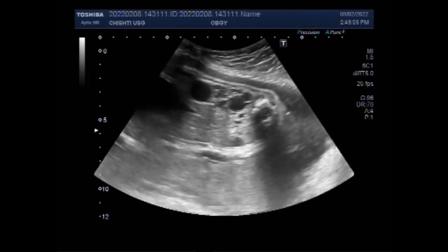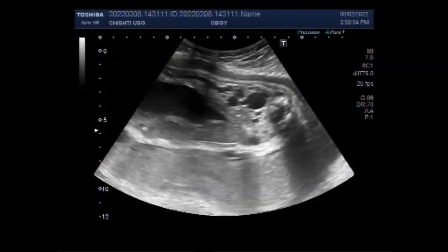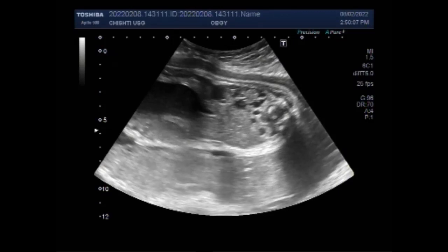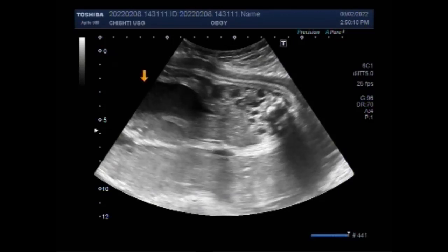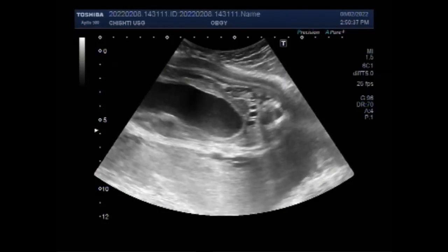Two stones are seen. You can see the stone shadowing. You will see very rarely a video or case report of stones in the fetal kidney. This is the kidney and this is a stone. In this picture one stone is visible. Now this stone measures about 8.8 millimeters and there is strong posterior acoustic shadowing.